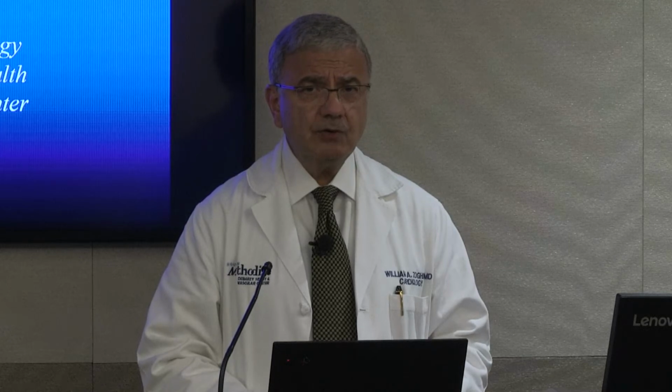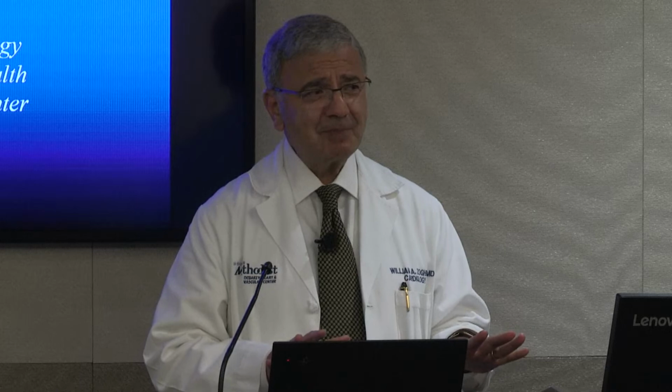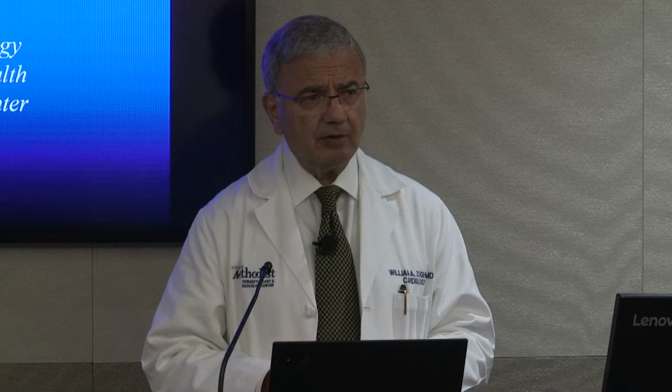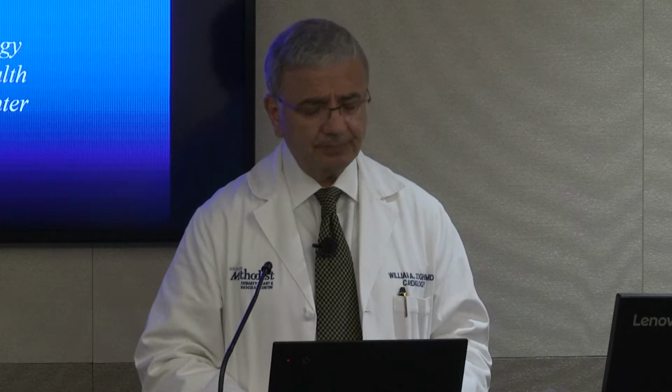And I know our fellows and our faculty converge almost immediately toward interpretation. I will caution you that you need to understand the basics of how the images are obtained, because then it helps you to ultimately be an expert at understanding artifacts, pitfalls, and issues that may come up in image acquisition. This is mostly germane to echocardiography because you are the person acquiring the images by hand, as opposed to being put in a tube where the images are acquired electronically.